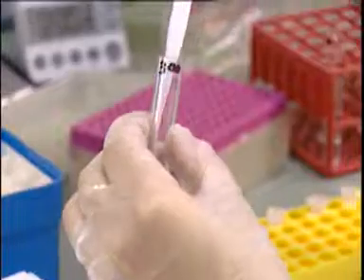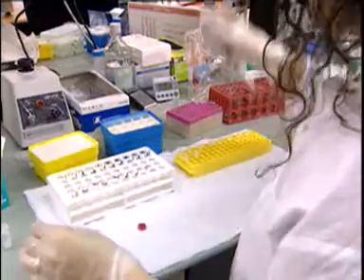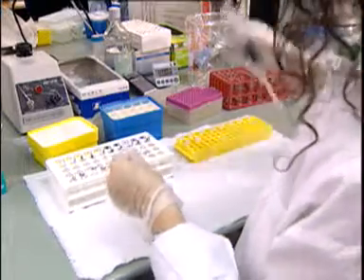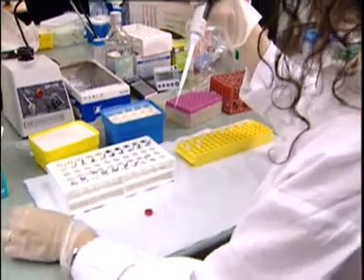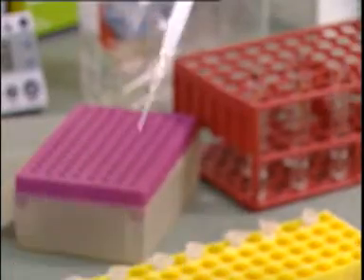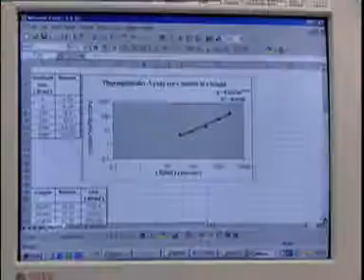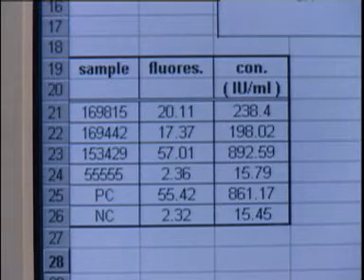In the next step, beads coupled with thyroglobulin antigen are mixed with the serum samples. After a short incubation time, a second fluorescent-labeled antibody specific to human immunoglobulins is added to detect the specific thyroglobulin autoantibodies. The reading process is simple, and the result of the tested sera are calculated from the calibration curve formula.